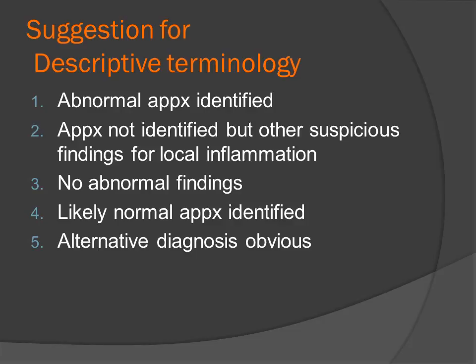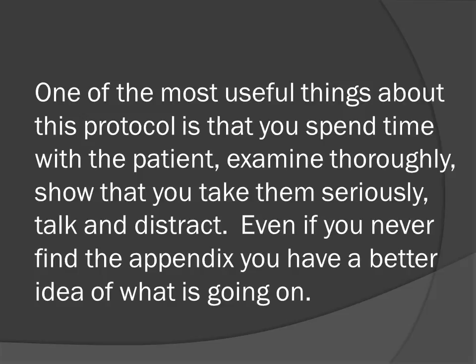If I have been lucky enough to find a normal appendix, I'll say so judiciously, and if I've found an alternative cause. But the bottom line, I have to say, is that the most useful thing about this procedure is that you spend a bit of time with the patient. You lay hands on and talk to them, you examine them thoroughly, and you take time to do this. Even if you never get a glimpse of the appendix, by the time you finish 10 or 15 minutes later, you have a far better idea of what is going on with this patient.